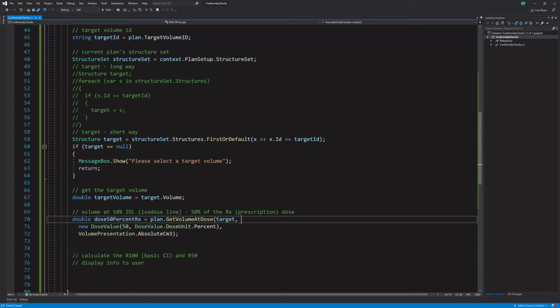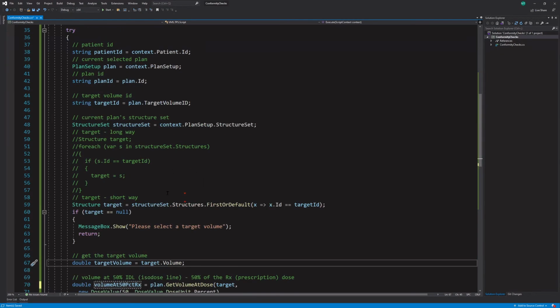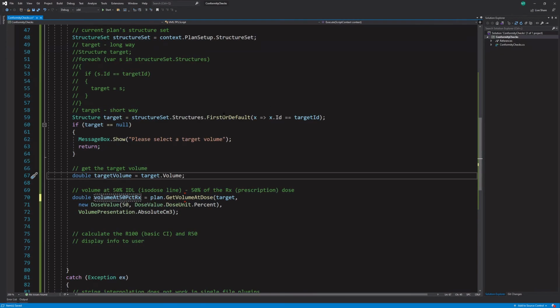So, and then we've named our volume at 50%. Whoop. Can't do that. Okay. Percent Rx. Volume at 50% Rx. Okay. Oh, you know what we did? We don't want to do this for the target. I'm so silly. We need the body. So first let's get the body.